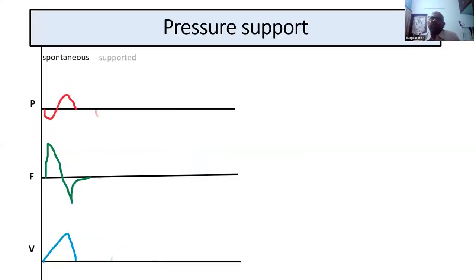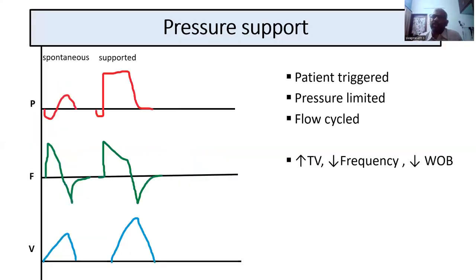So what is the advantage of using pressure support? It will increase the tidal volume, it will reduce the work of breathing, thereby it will enhance the weaning process. But there are still some problems with it.